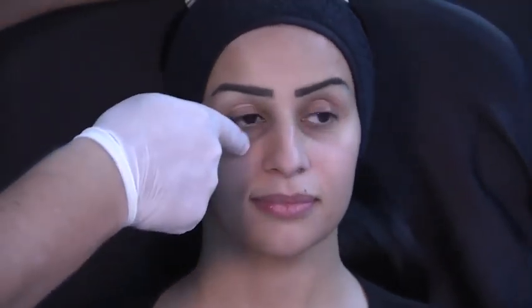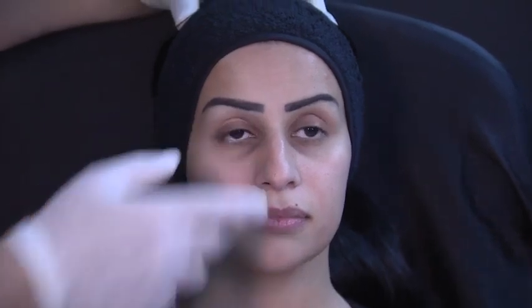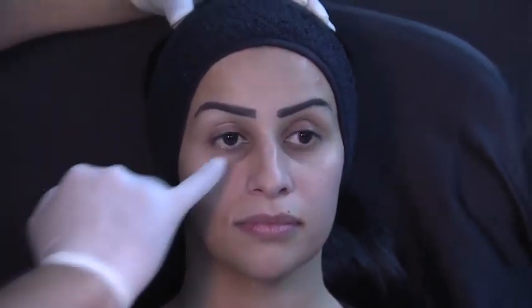But when I only need 0.15, and it's only a little bit to improve that tear trough, I don't want to take the risk of having to do a cannula treatment, which is a little bit more uncomfortable, and I don't think that for 0.15 it's worth the cannula treatment. A direct approach in the tear trough with that needle was enough in this case. Now we have a deeper tear trough. This is a different case, okay?